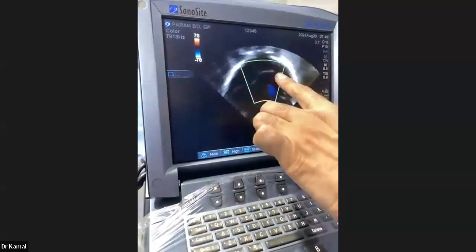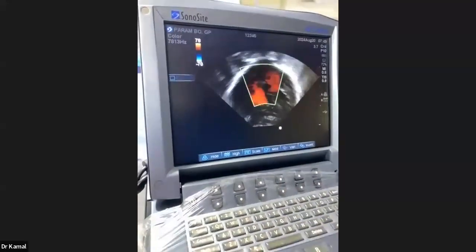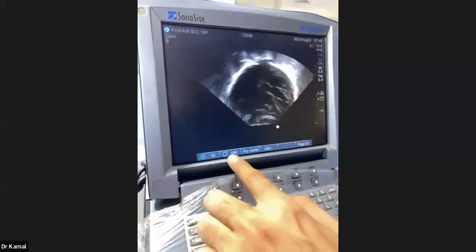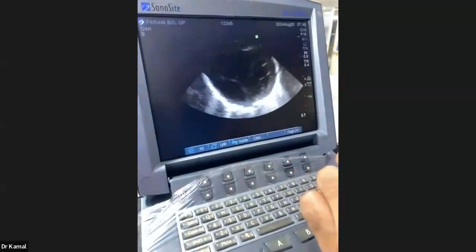Fine. Then I can see the mitral valve, E/A ratio. This will all be taught to you. The tricuspid regurgitation. So this was up, down, and this. So I can again go back. So again, I have reached the same point.